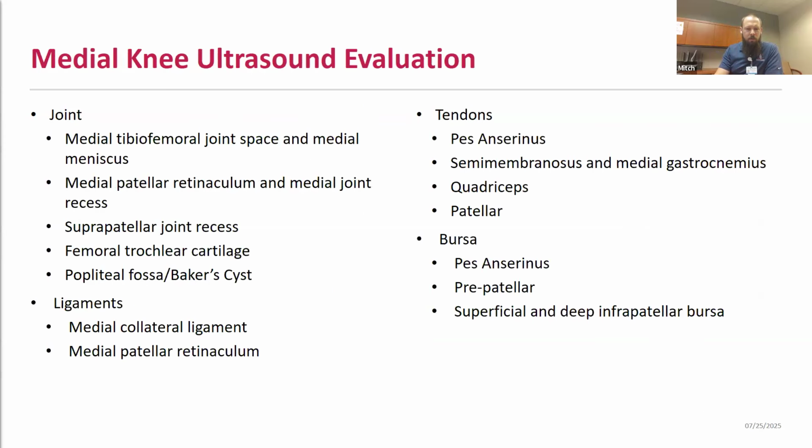And so today we're going to talk about ultrasound evaluation of the medial aspect of the knee. And then we're also going to take a look at some adjacent structures more towards the anterior, as well as going back to the posterior aspect of the knee. But the main structures that we're going to evaluate for the medial knee include the MCL, and with MCL evaluation, including valgus stress if indicated. We're going to talk about the medial meniscus and evaluating that throughout the tibial-femoral joint space. Specifically, we'll focus in on the Pes Anserine tendons and the bursa as well. And I'll demonstrate both normal anatomy and then the abnormal anatomy we saw with this particular patient.